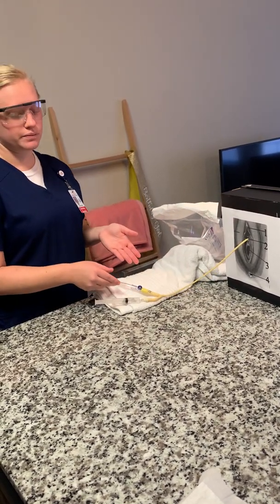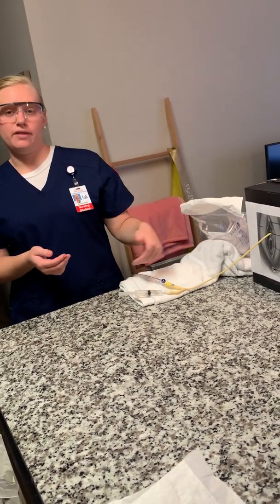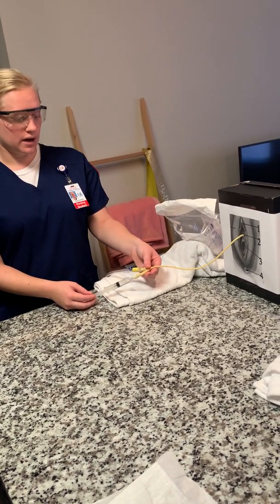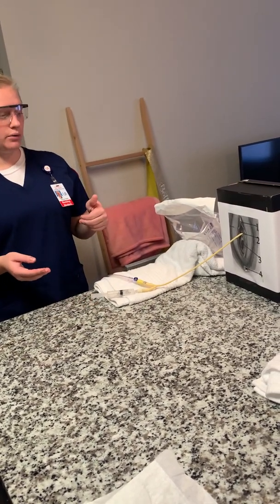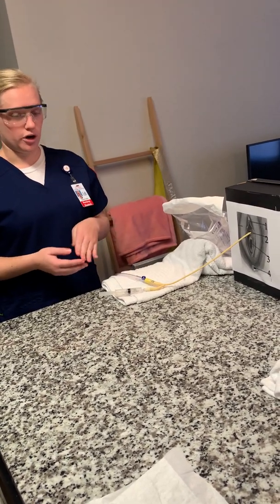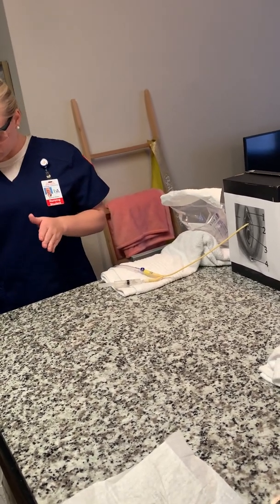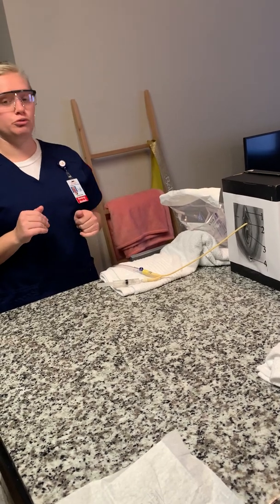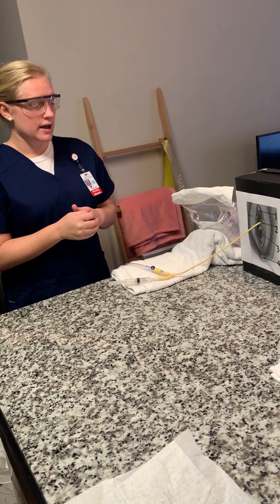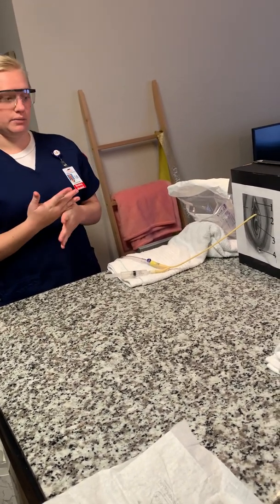Okay, so usually I would let it all come out before taking the catheter out, but it's not coming out in a timely manner. So for time's sake, I'm just going to move on. So usually I would take it out after I make sure all the water's out. And I would throw everything away in my trash can. Then I want to perform perineal care again, just like I did earlier to my patient. And then I can remove my gloves, perform hand hygiene, and then I want to document.